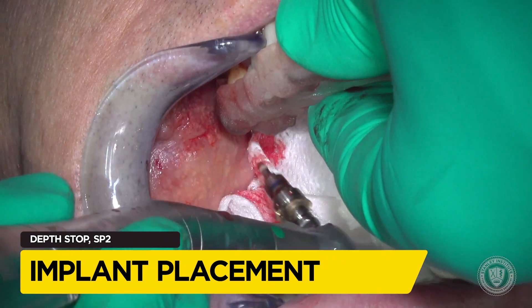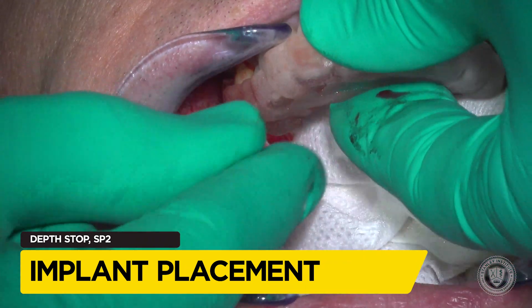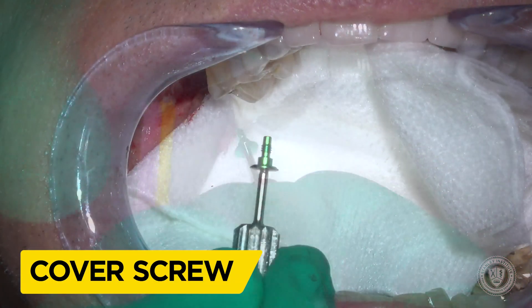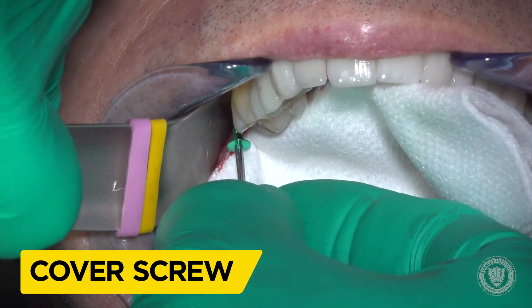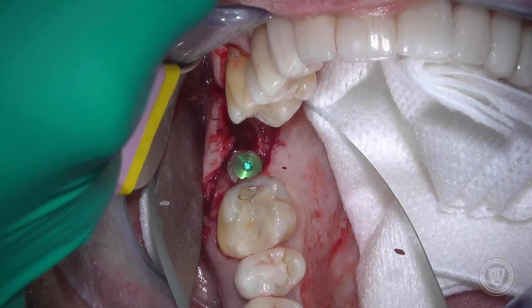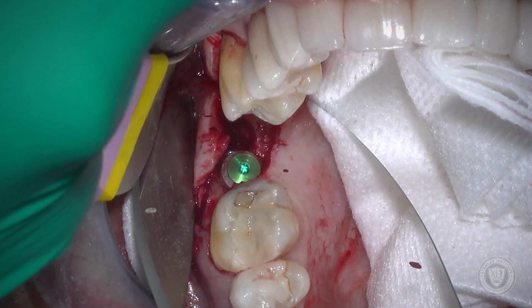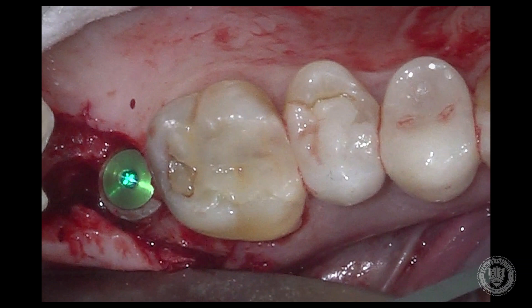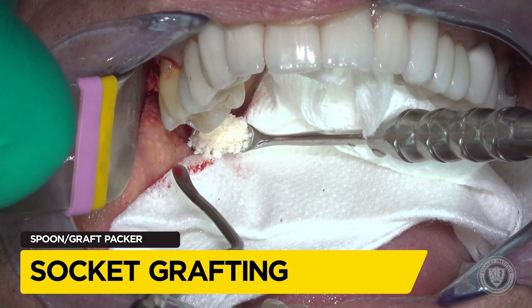Depth has been acquired. We remove the driver and remove the surgical guide. We're going to place a cover screw because we're going for primary closure in this case, so a flat cover screw goes on the implant. You can see the original osteotomy in the bottom left, and watch as we bring in the original implant — that's how far off it was from the desired position shown in green.